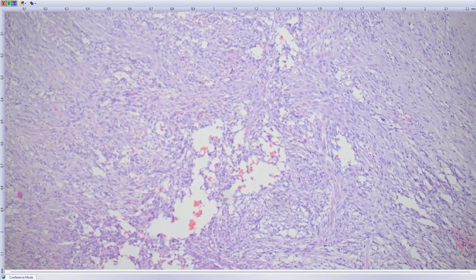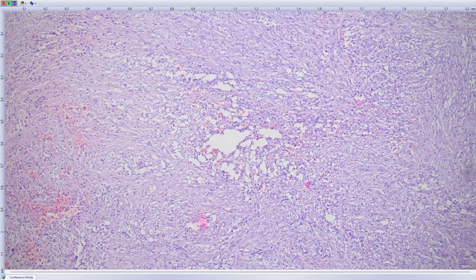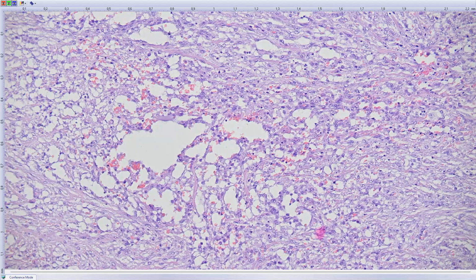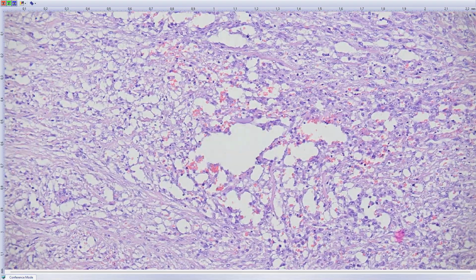So don't get confused by the cellularity and high mitotic activity. You shouldn't see atypical mitosis, or at maximum maybe 1, but definitely not widespread atypical mitosis. And it's usually a tumor located in the subcutis or dermis, not deeper. So here again, this is a textbook example of nodular fasciitis.